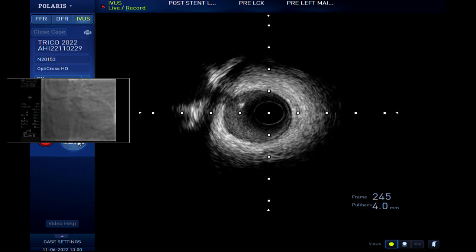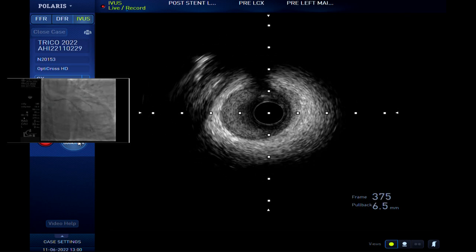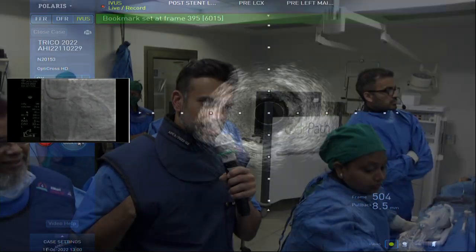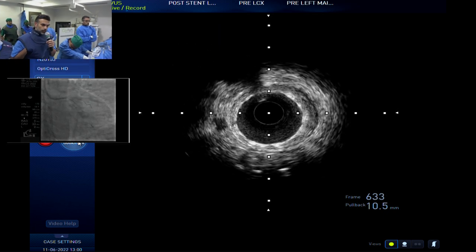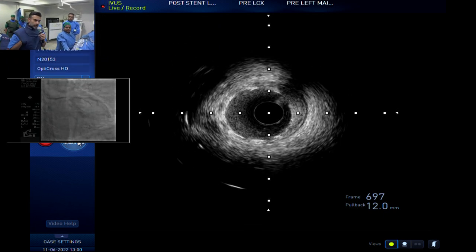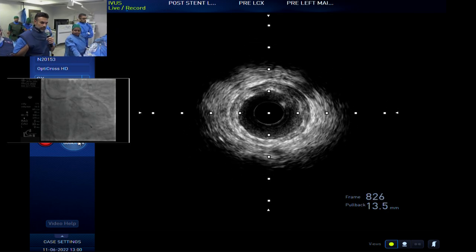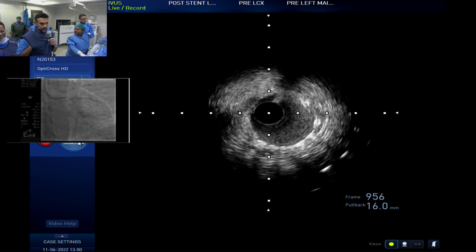Is this technique only limited to non-complex PCI? I'll present a case later today where I did a bifurcation left main CTO OM1, bifurcation circ CTO OM CTO, and it was zero. So it's doable. It's not a hard procedure. All you have to do is use the same principles.